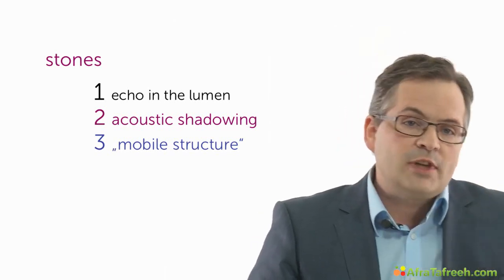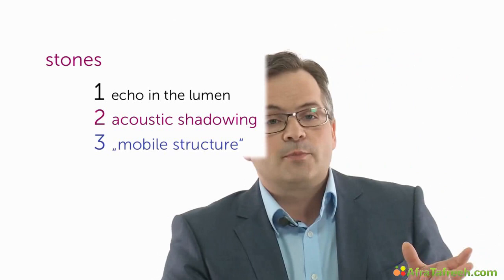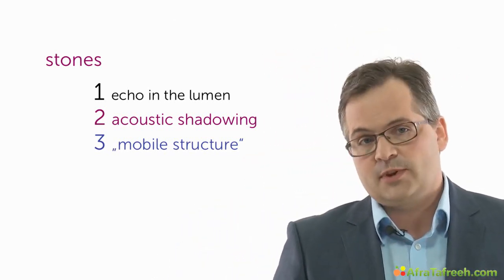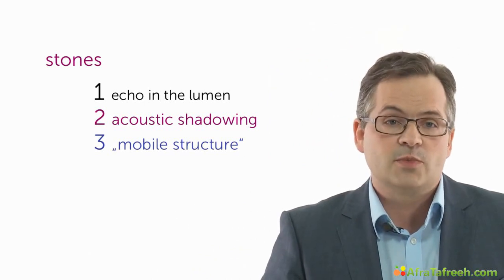Stones will move freely within the gallbladder when the patient's position is changed. Tumors of the wall will not be moving, and this is how we can distinguish between these two. Always remember the 3 criteria of a gallstone: echo in the lumen, acoustic shadowing, and free movement of the stone when the position of the patient is changed.